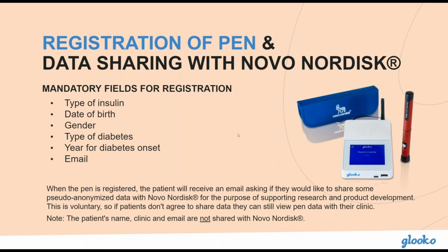And the reason for this is that after registration, the patients will receive an email asking if they would like to share some of their pseudo-anonymized data with Novo Nordisk, again for the purpose of supporting research and product development. As said previously, this process is voluntary, and if patients do not agree to share data, they can still view pen data with their clinician, and they can withdraw this consent at any point. It is worth noting that the patient's name, clinic, and email are not shared with Novo Nordisk.